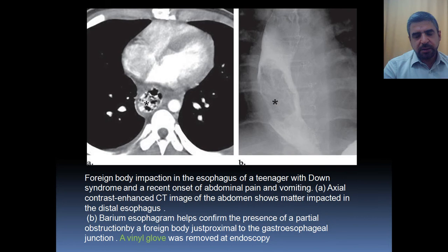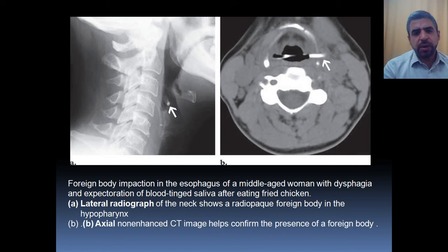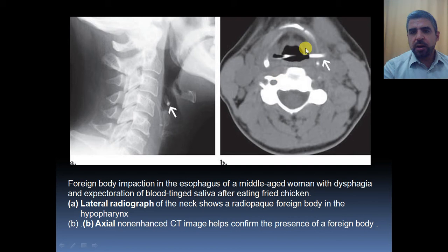This is a middle-aged woman with dysphagia after eating fried chicken. The lateral cervical X-ray shows a bone within the hypopharynx, and on the CT scan the bone is clearly seen on the left side of the laryngopharynx.